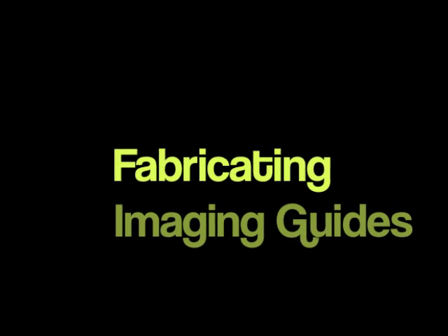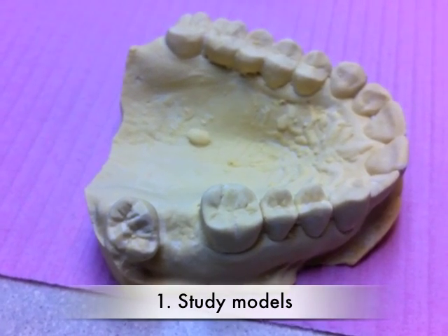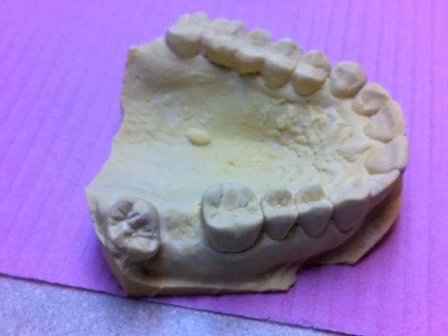So here is how you can fabricate imaging guides. First, take impressions for study models. If you have a relatively simple occlusion with several missing teeth, you'll be able to make the imaging guide yourself.